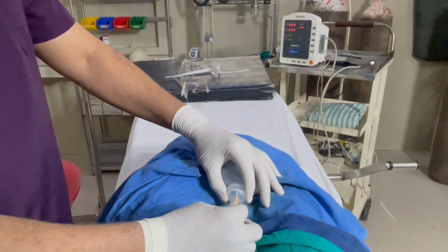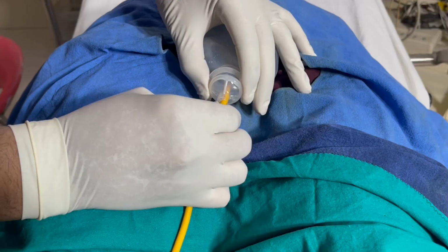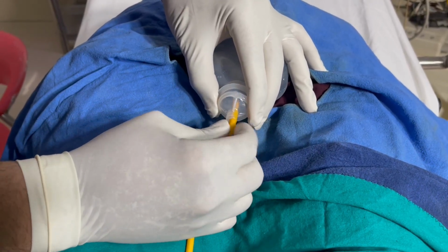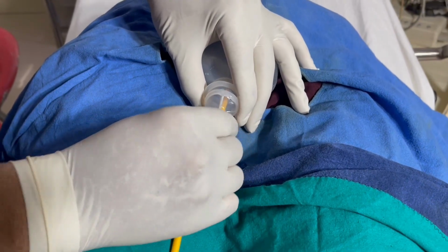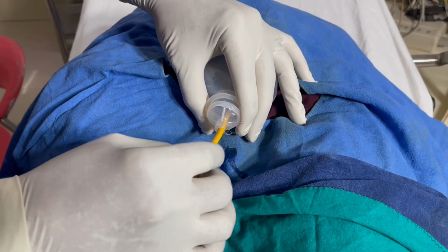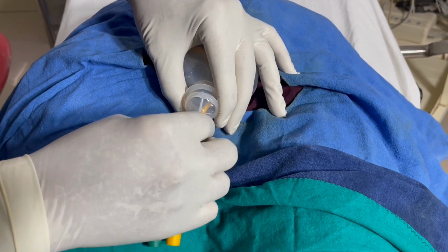When I push it, once a little bit of the part has gone inside, if the person is getting resistance, Mr. David, I will just try again. If he gets no pain, the complete catheter has to be introduced. Because of spasm, you may get some resistance, so I will ask him to take deep breaths so that it will be easy.